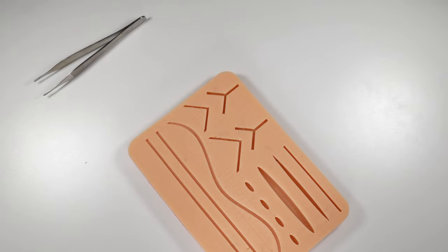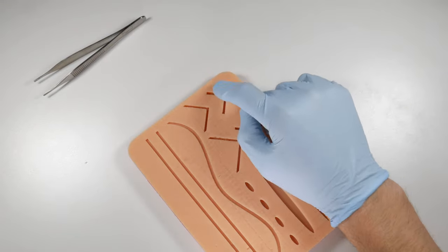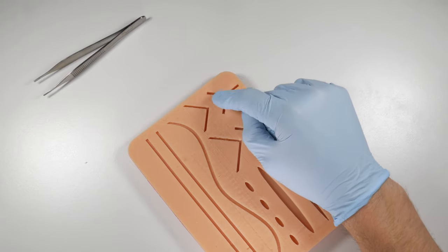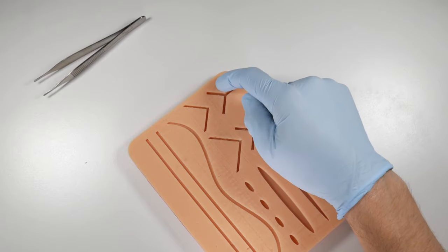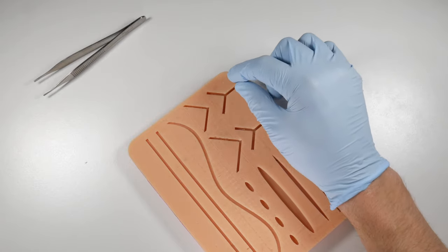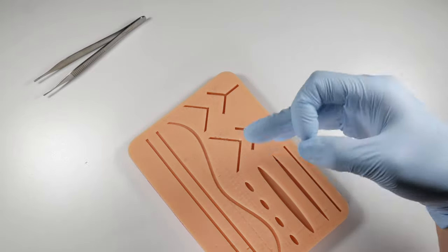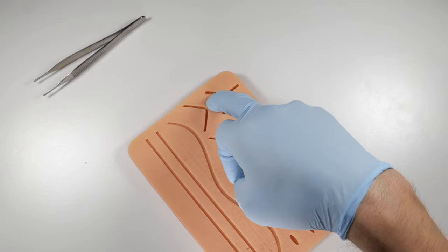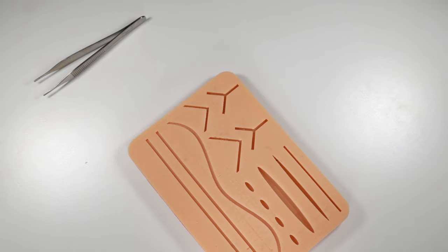Whenever possible, try to suture so that your knot will end up on the buccal surface of an extraction site. The reason I say that is because it's out of the way, kind of far away from the tongue. Your patient will have less propensity to try to poke at it or play with it, which is going to mean that it's going to come untied much less than if you left your knots on the palatal aspect or the lingual aspect of the teeth.